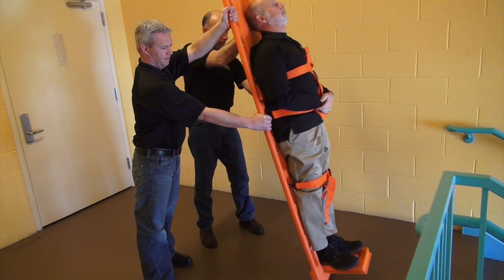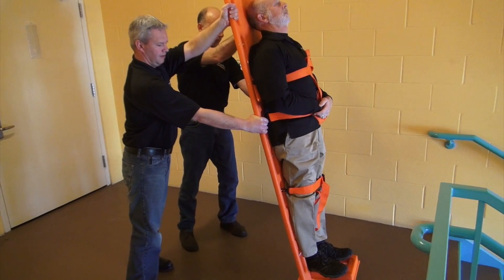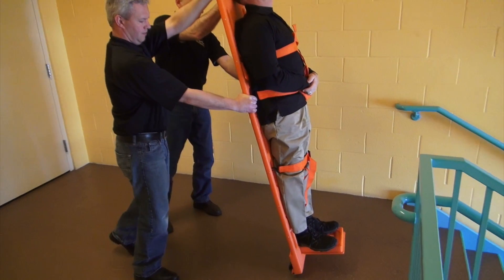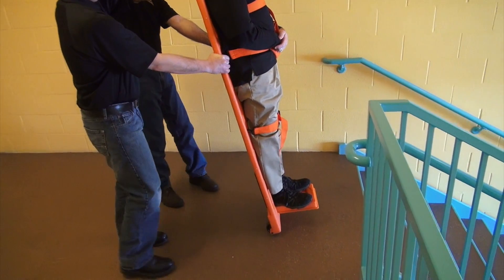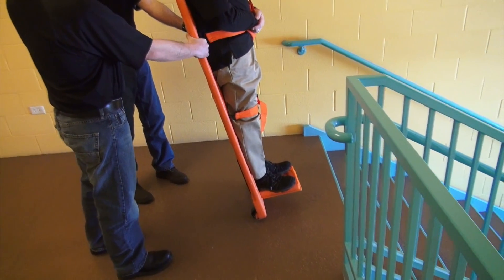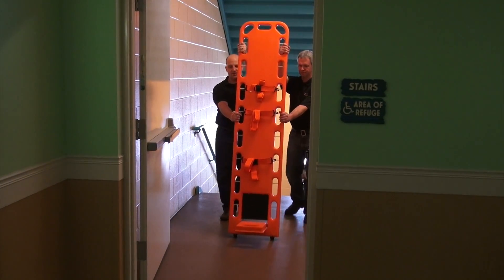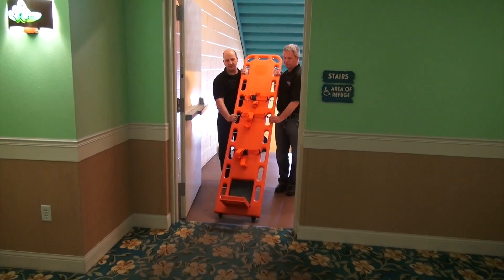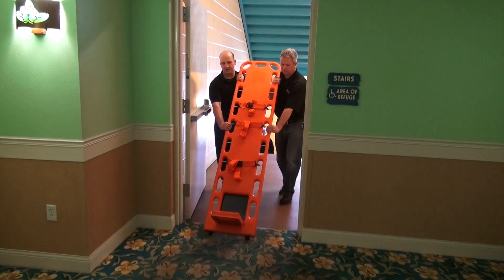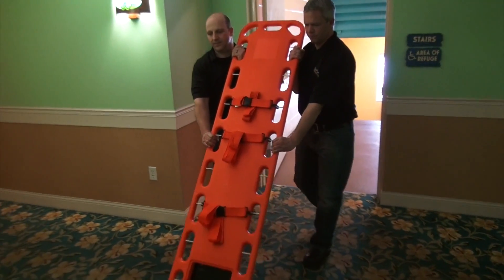To move the patient on an uncarpeted floor, align the patient's center of gravity over the wheels. The patient will be close to a standing position, making them easy to move without heavy exertion. When moving a patient on a carpeted floor, tilt the board back before moving. This will allow you to get the board started in deep pile, padding, and other soft surfaces.